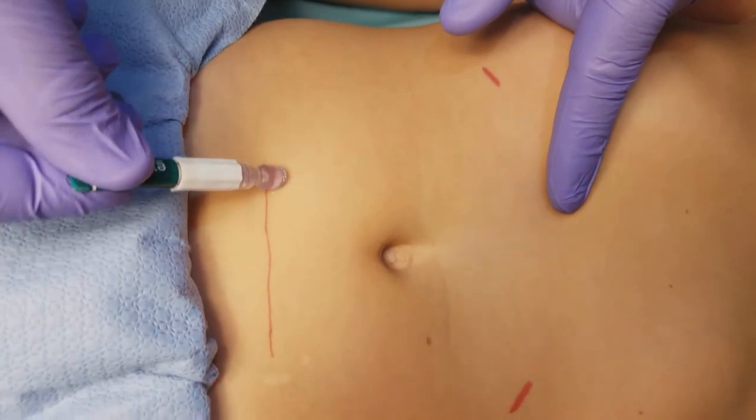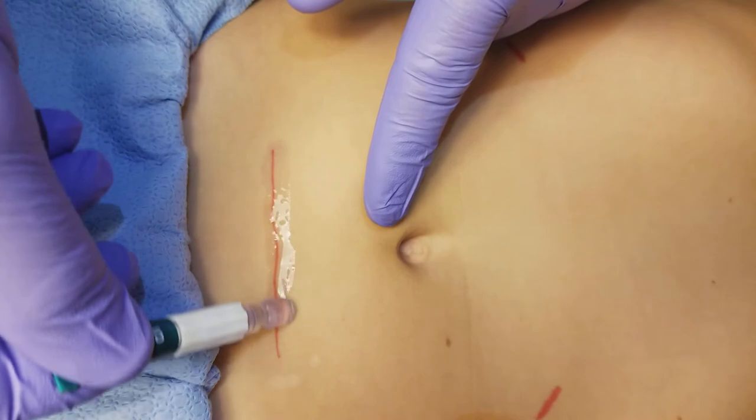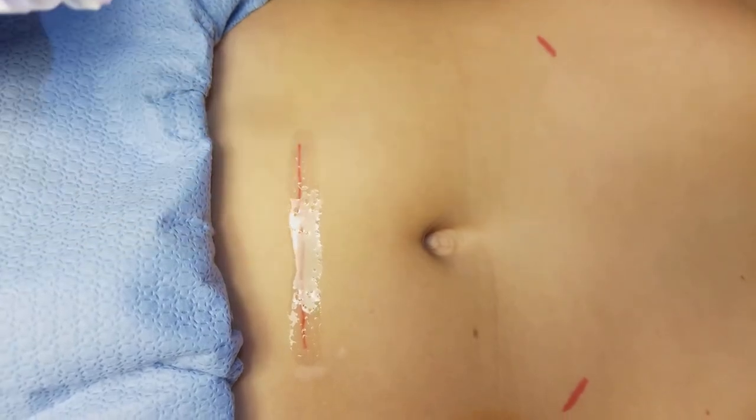Gently squeeze while going in a back-and-forth motion over the wound, just like so. Just make sure your edges are approximated and rub the glue over the wound just like that.